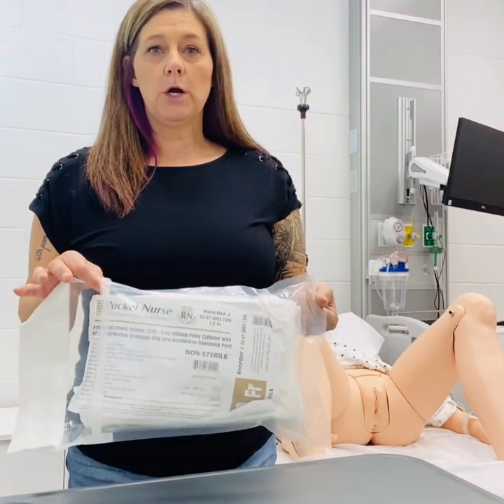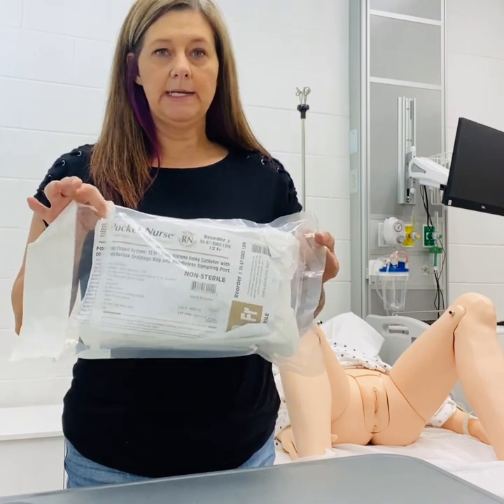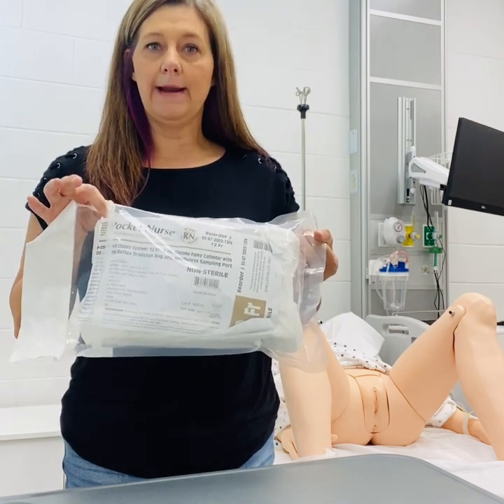Everything that you need for Foley catheter insertion comes in a little kit, so we're ready to begin.